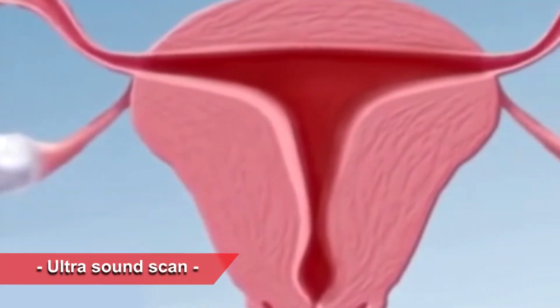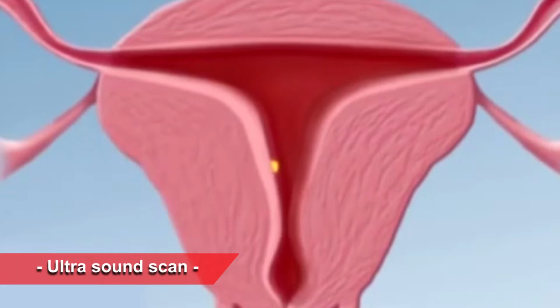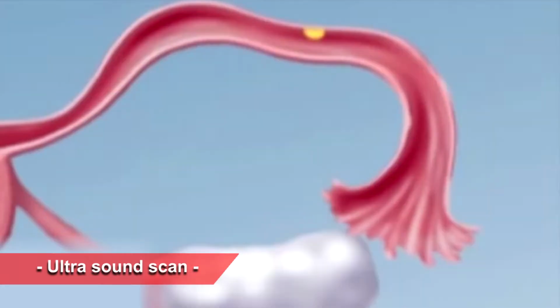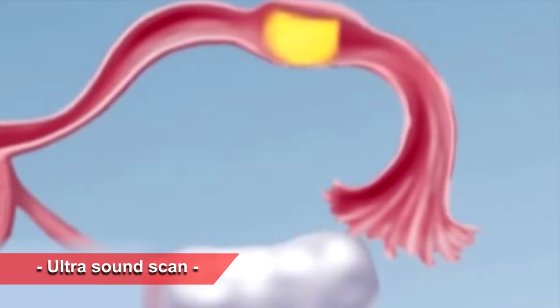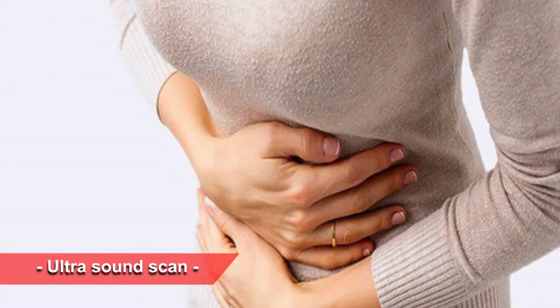The first scan she needs to do is as soon as she gets pregnant, which can be around 6 to 8 weeks. Why it's important is because we need to know whether the pregnancy is inside the uterus or implanted anywhere else. If it is anywhere else, it is called an ectopic pregnancy, which is a life-threatening condition if not diagnosed early.